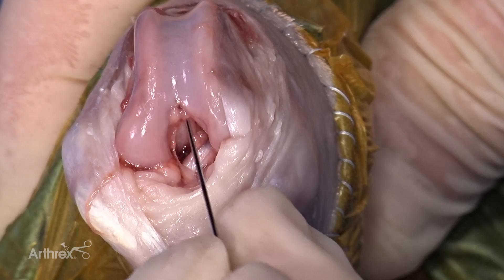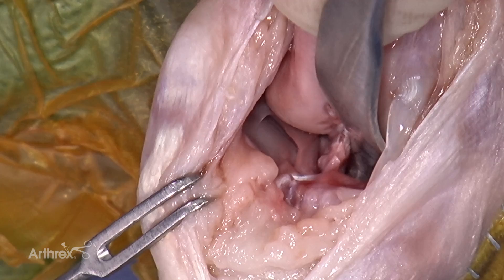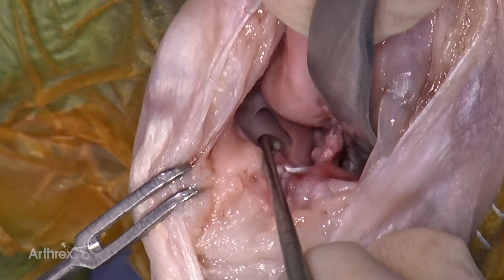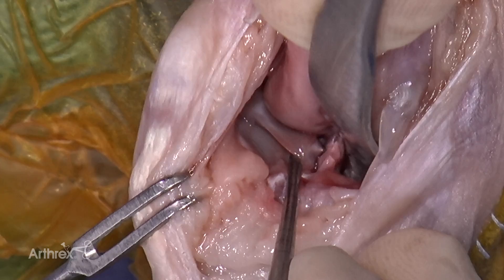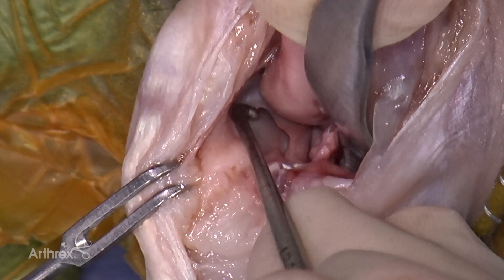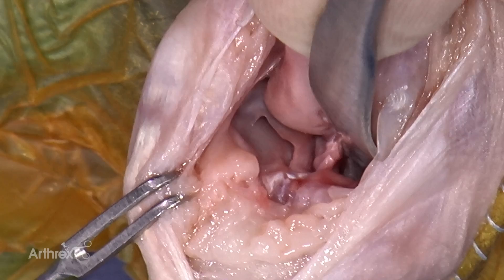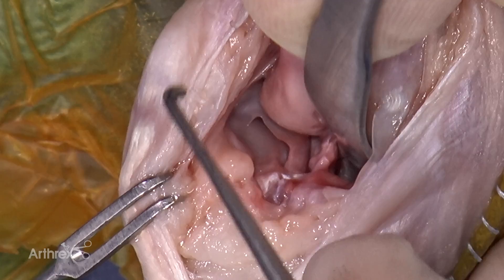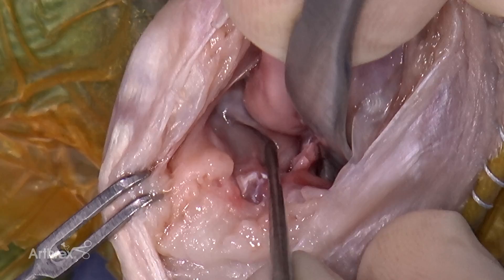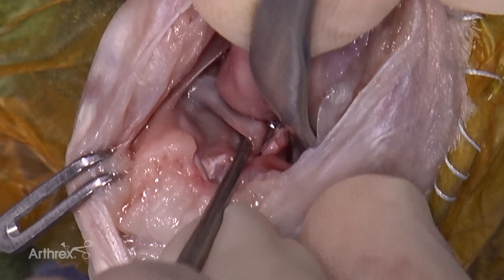This is the cranial cruciate ligament here, and here is the caudal cruciate ligament. This is the long digital extensor tendon right here. We have the Hohmann in position. Now we're looking at the medial meniscus — this is the caudal ligament of the medial meniscus, where you do a meniscal release if you choose. This is the caudal body of the meniscus. That little caveat right there is called the flounce. It's important to look at the flounce because if it's present you're very unlikely to have a meniscal tear. Nevertheless, you still want to probe the caudal horn — this is where the tears are going to be. A bucket handle tear will look similar, and if you have a bucket handle tear that flounce is gone.